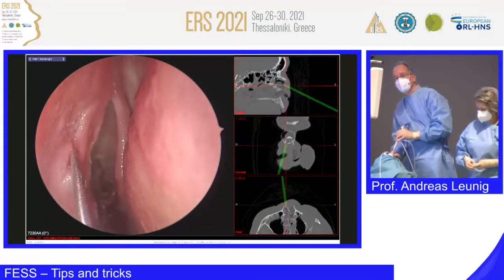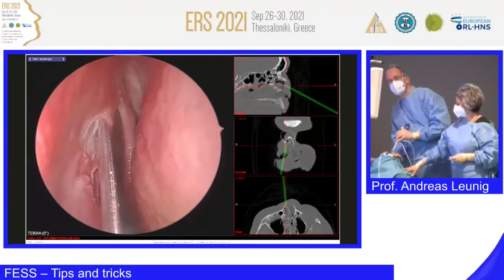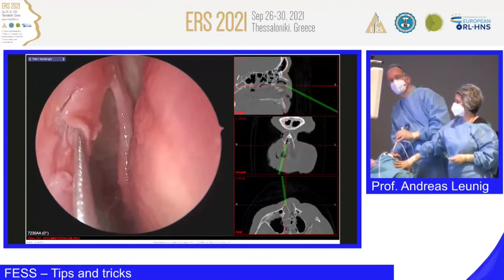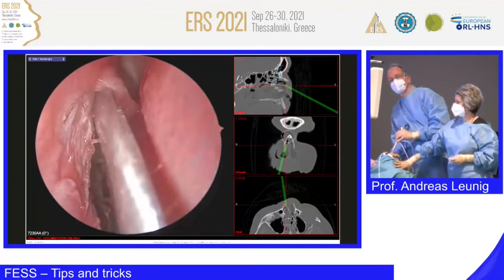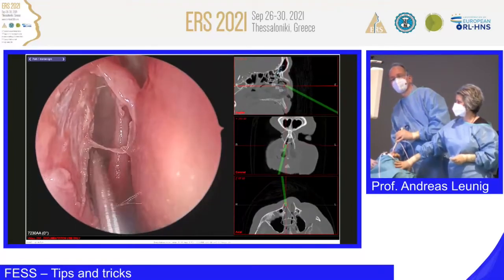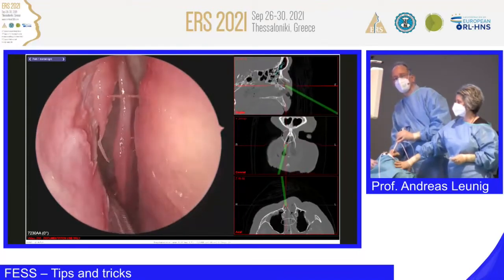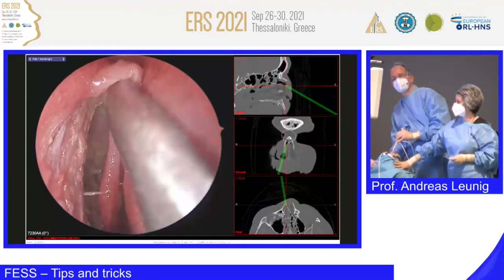So now I'm preparing this. And this is not a standard procedure. It's just to show you the different possibilities, and I think it's a better approach from internally than from externally. Okay, so then the through-cutting, the cutting Blakesley.